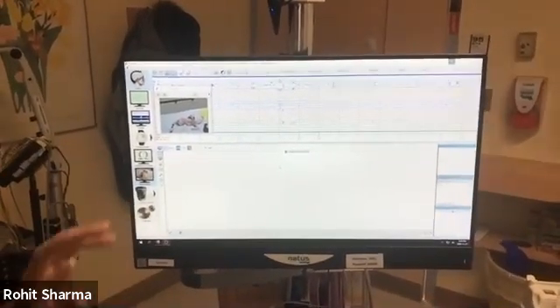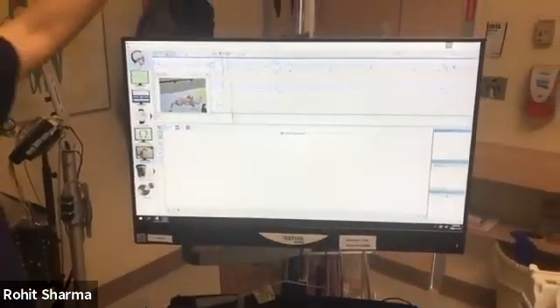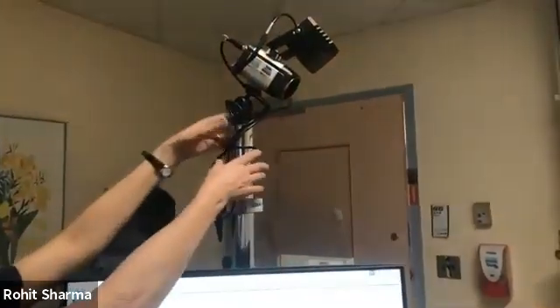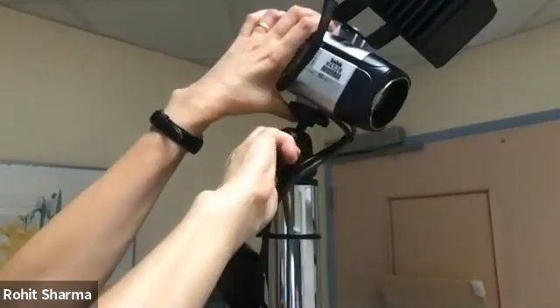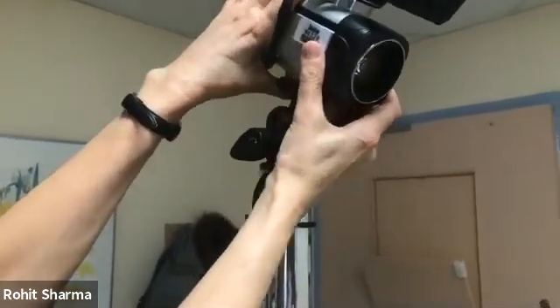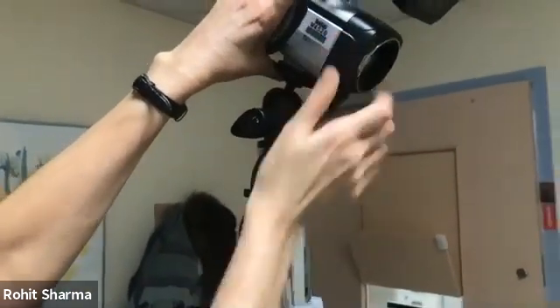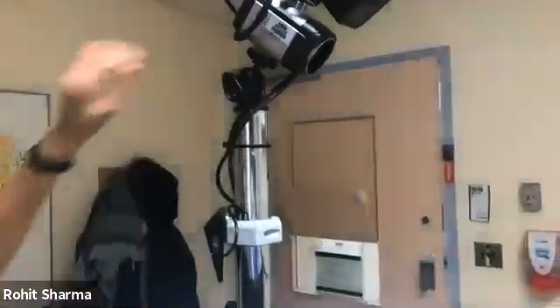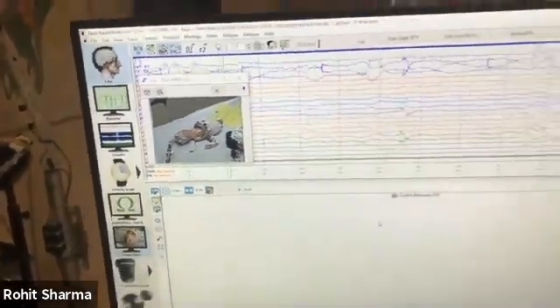And like I said, you can always call us back if you want. The other thing I just want to tell you is the camera. Once you move a patient, you'll notice that the camera might be in a different place. There are two ways to move it. You can turn the whole stand around, or from here, this helps the camera twist around and go this way. Make sure the patient is always on the camera, and tighten it up. So just be mindful of making sure the patient's always recording on the camera.